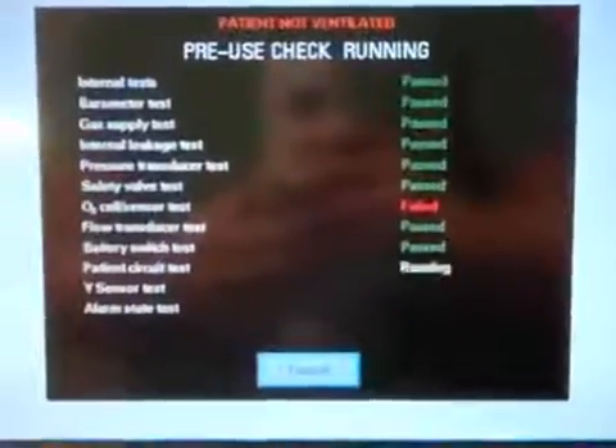It's now saying to connect the patient circuit and block the Y. Pop off the test tube, put the circuit back on, block the Y as commanded, and it will pressurize the circuit. Then unblock the Y. It asks if I want to compensate for compressible volume — yes. It's telling me it did not perform the Y sensor test as nothing was plugged into that module. Everything else passed except the O2 cell, which we know the reason for.